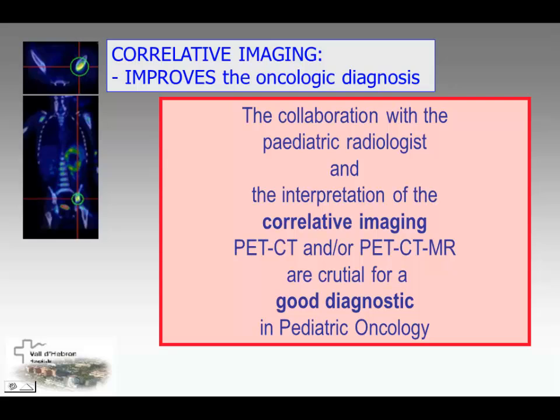Thank you very much for your lectures. I just want to ask Dr. Isabella, you mentioned CT for attenuation. Do you really find CT for attenuation correction in children really useful, or only for anatomic localization?